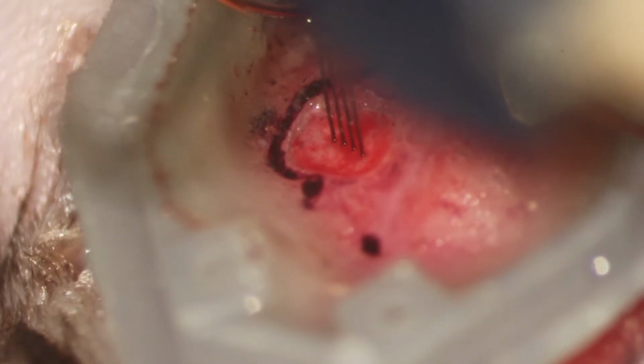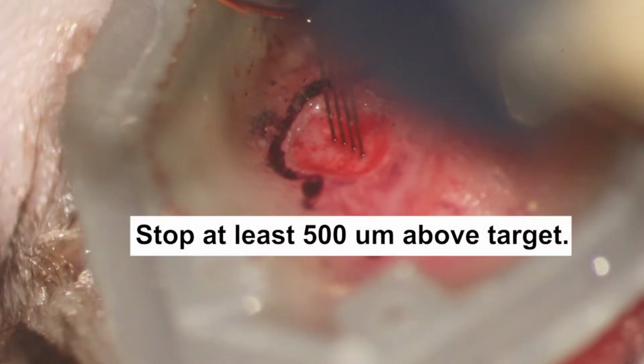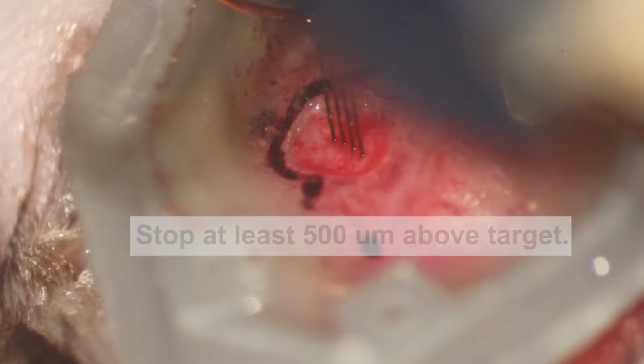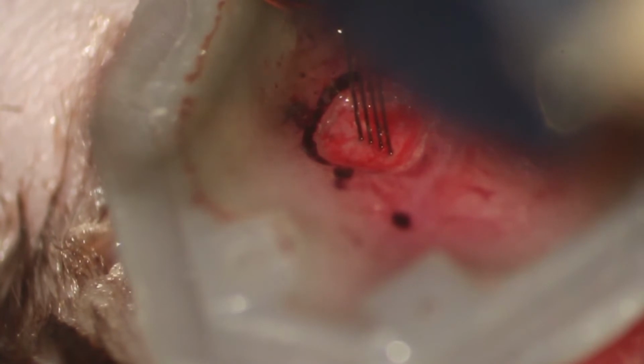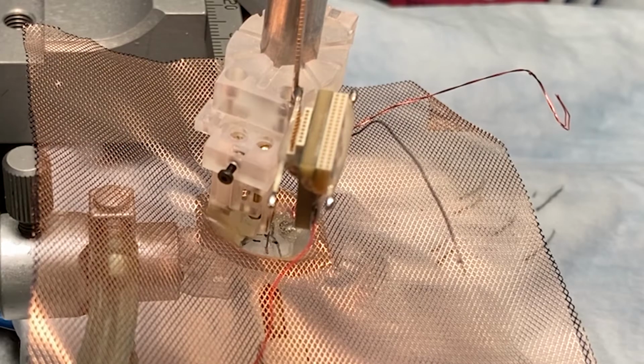One extremely important thing to look at this point is whether all 4 shanks are parallel relative to each other. If you see one of them is bending or not parallel anymore, then you need to stop and start again, and see why it's not going into the brain. Maybe there is a dura particle or a bone particle, but you need to make sure you don't break your device during insertion. And once the device is in place, you seal the craniotomy with biocompatible silicone or wax.